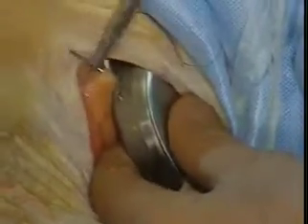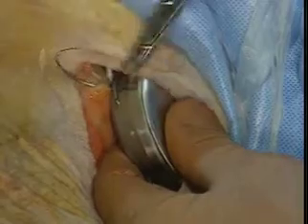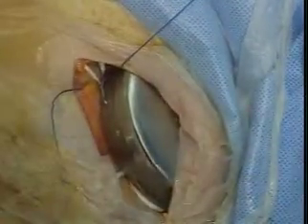Failure to do so could allow the catheter to pass over the superficial surface of the pump and result in a catheter puncture from a refill or catheter access port needle.